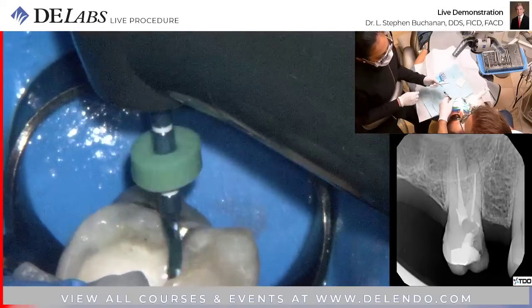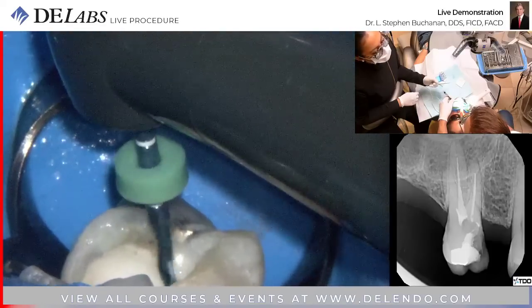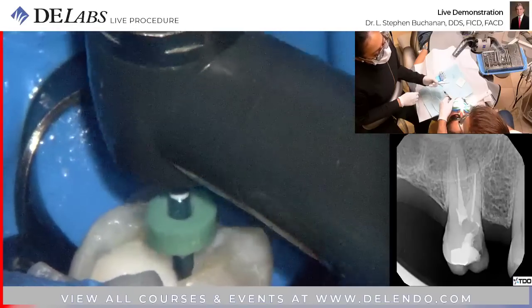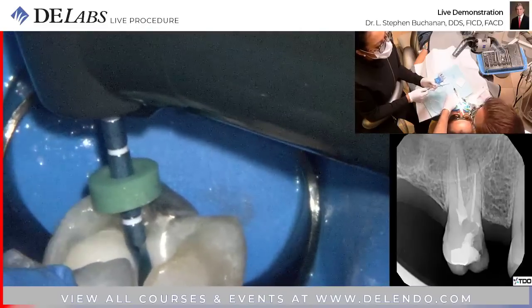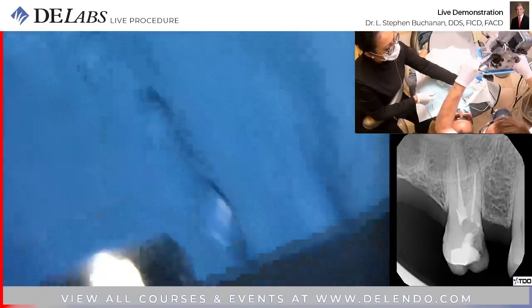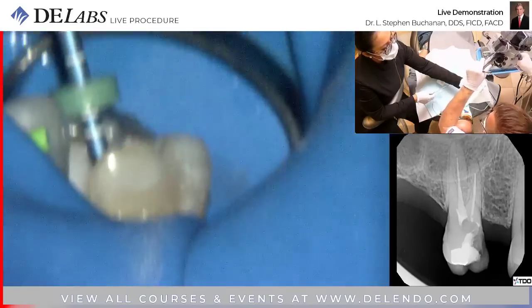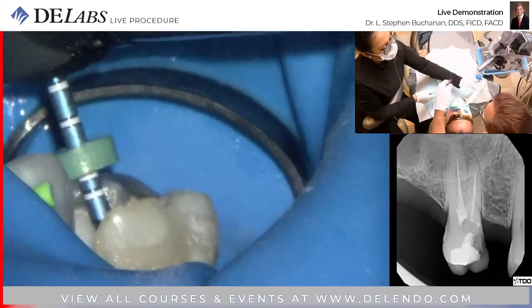Okay, so it starts when it meets the solution, when it has a little bit of a charge in it. We're at length. This is a distal buccal. I'm going to reference it. Hold this a sec. Let's get a better view here. We're going to reference this by the palatal cusp tip. Palatal cusp tip is my favorite upper molar reference point.